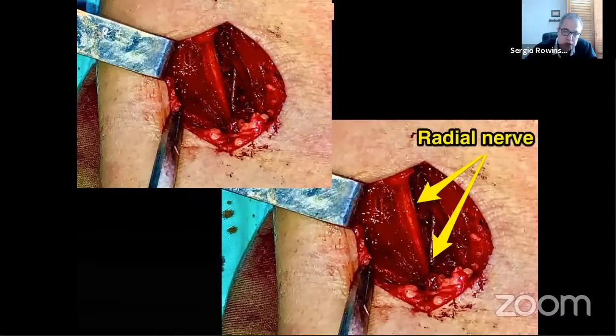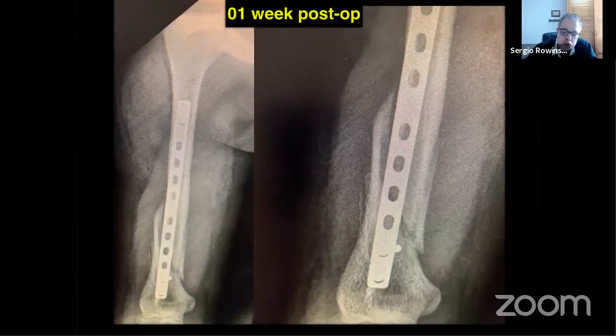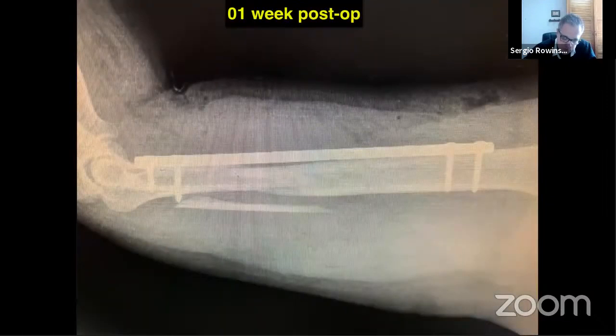This is the radial nerve. This is 1 week post-op. We have to remember that the olecranon fossa is posterior. So if you go this distal, you will not have problems with elbow flexion. I'm going to show you now. And this is the lateral view. I always put 2 screws in the 2 penultimate holes, always non-locked.